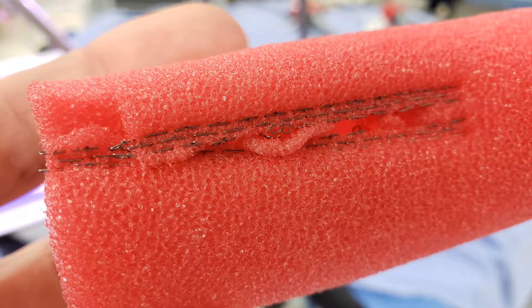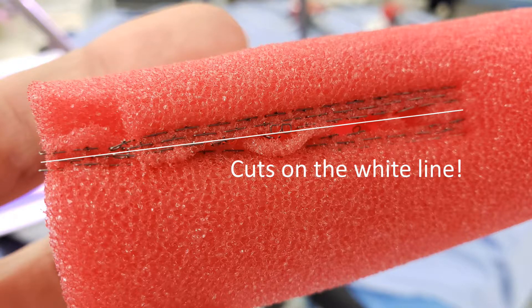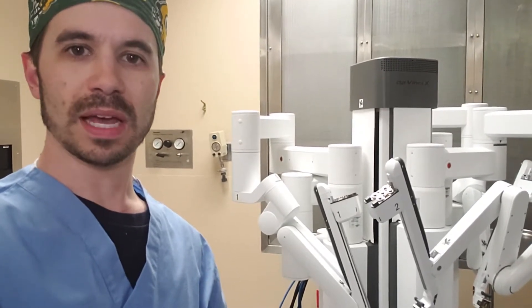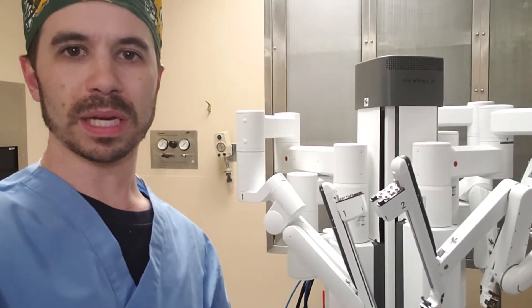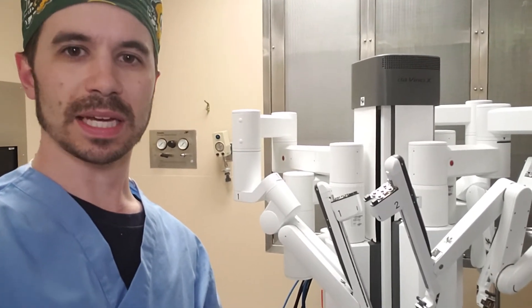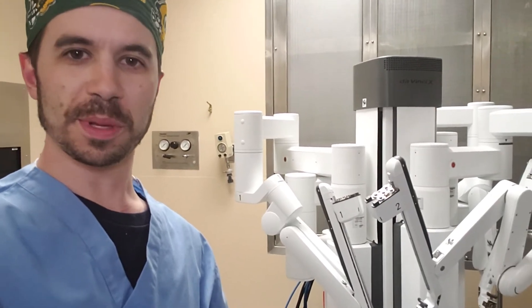What it does is it puts staples on either side and then cuts down the middle to attach the tissues together. We also use staplers for a sleeve gastrectomy, where it takes the edges of the stomach and reattaches it to itself on either side of the sleeve. The remaining portion of the removed stomach is also sealed to itself so that it doesn't leak out any stomach contents when it's removed from the body.